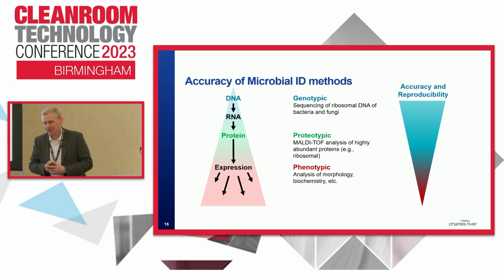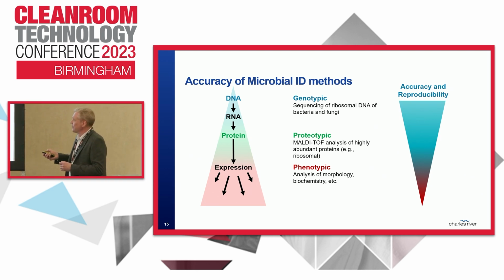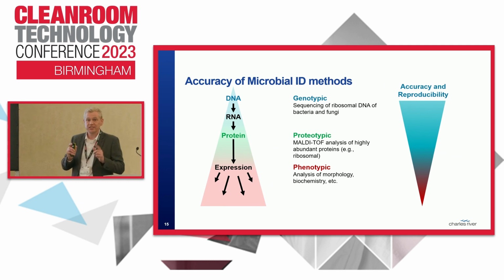One thing I would just like to add as a sort of side note to this, these technologies are used commonly for routine ID. But there are some groups of organisms that are so closely related, that they are different species, that they can't be distinguished with MALDI or even sequencing. Not the routine sequencing that I've mentioned, 16S and ITS2. Okay? And I'll come on to that.